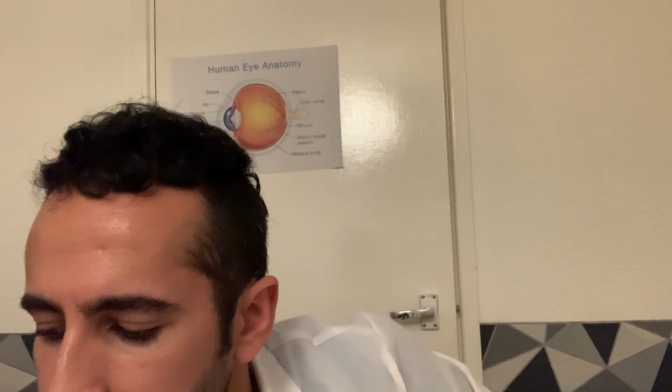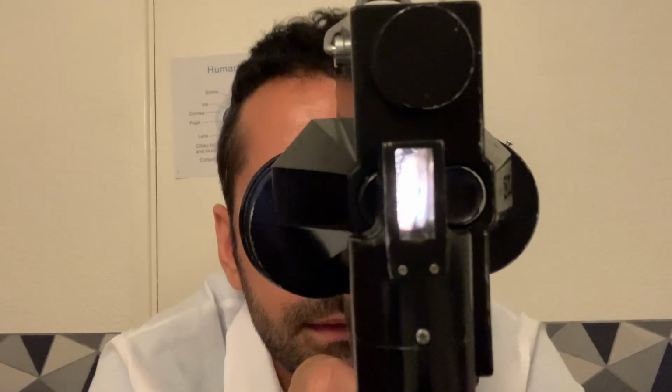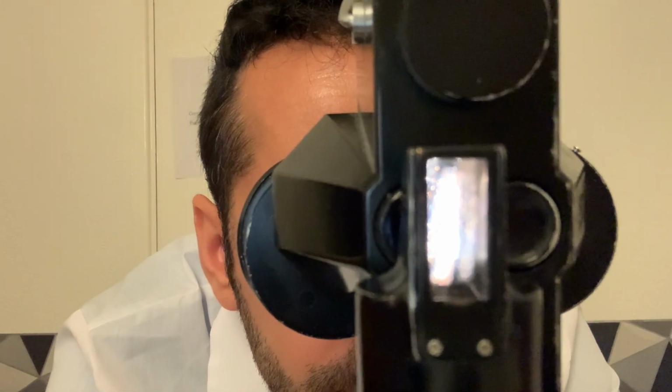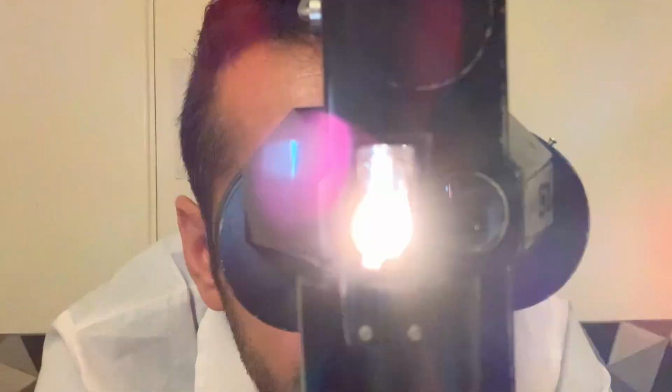And we'll do a quick health check of the eyes with the portable slit lamp. Focused correctly. Okay, looking at my right ear so I can check the health of the eye there. Okay, now looking to the right, to the left, just up to the ceiling and down to the floor. Excellent. So we have a very white conjunctiva, minimal hyperemia, no discharge. You're not experiencing any discomfort in the right eye. Excellent. Okay, looking at my left ear. If you don't see the ear, just look straight ahead. There we go.